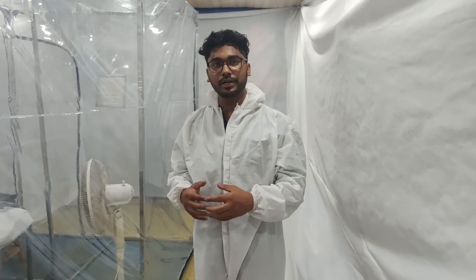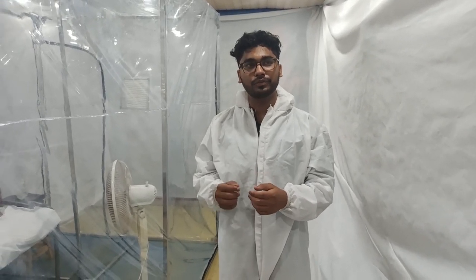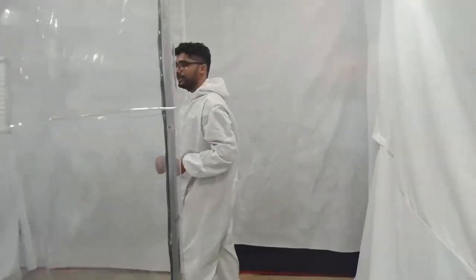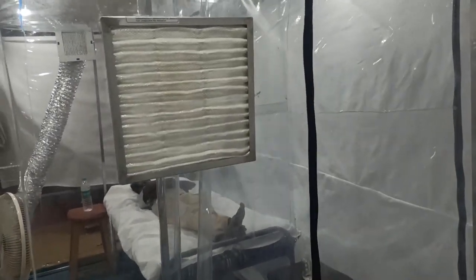Hello everyone. This variant of portable isolation room has a negative air pressure maintained inside. Let me give you a walkthrough. This is a pre-filter through which fresh air is sucked inside the room.